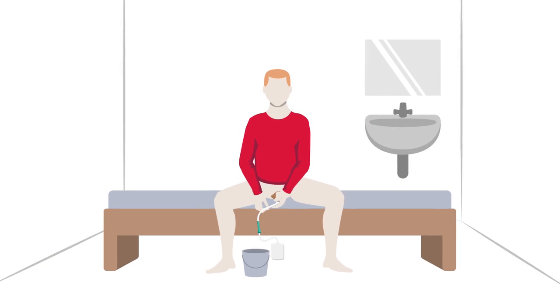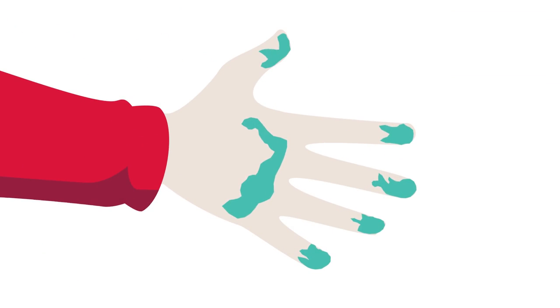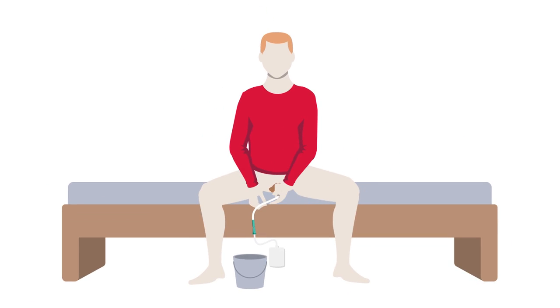The biggest risk factors for contamination are surface contamination from the surroundings and also by not cleansing the hands and genitalia effectively. Bacteria can be present on unwashed body parts, even if they seem clean. Following the aforementioned steps can reduce the risks, but the protection is increased by using the correct intermittent catheter.